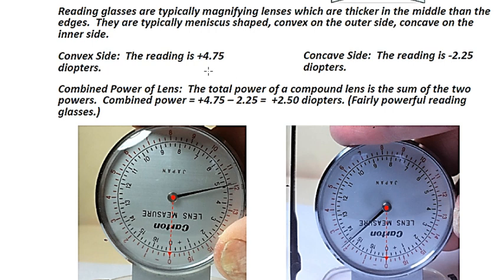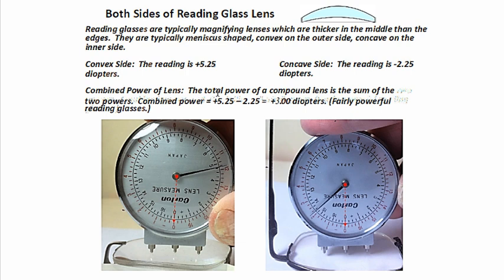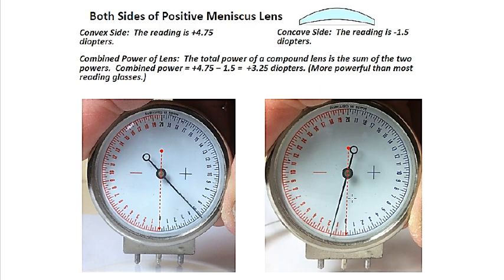So let's go ahead and change this here. I change this, and I will update your handout for you. You should get about 3. So anyway, you kind of get it. Some people have issues reading, maybe they didn't see it or something. I don't know. Anyway, that's how you read your diopters.